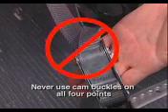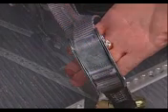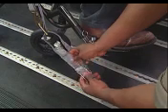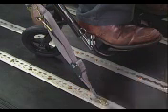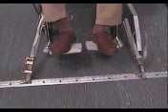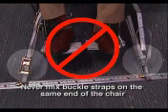Never use the cam buckle straps on all 4 points of attachment. It is recommended that they only be used as front tie-downs. The cam buckle strap is primarily a slack-removing device and can only tension to the extent of the operator's strength and angle of pull. Never use different styles of buckle straps for the same end of the chair.